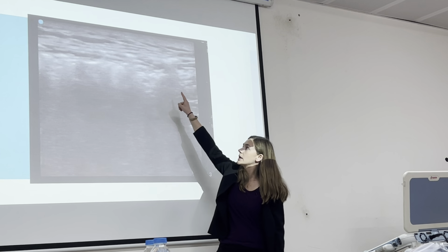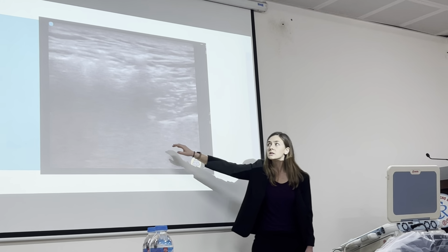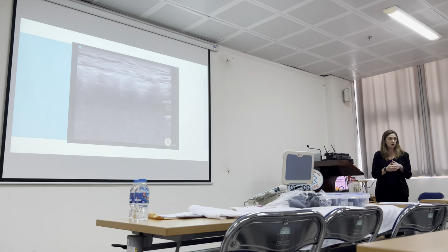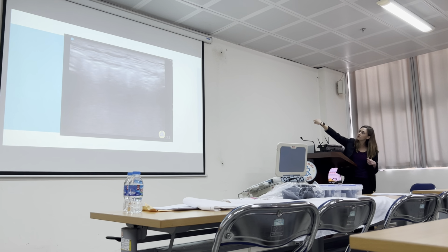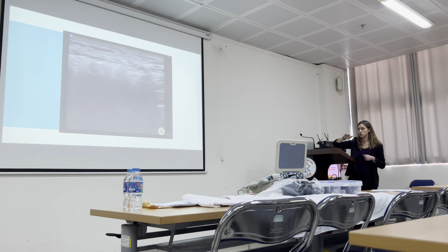And we're seeing some layering of fluid instead of just the cobblestoning. So this is concerning for necrotizing fasciitis, where you start getting that gas inside of the tissue and especially along the fascial layer. And you'll start getting that fluid instead of giving some of that cobblestone appearance, which you see in the beginning of the clip, to seeing it start to layer out in more linear structures.